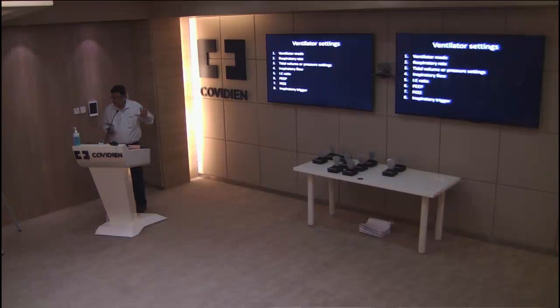And remember, pressure support is not a weaning mode. Pressure support can be used as an initial mode of ventilation also in a patient who's spontaneously breathing. Obviously, in a patient who's under anesthesia, you can't use that. But in a patient who's spontaneously breathing, pressure support can be used initially. You should keep the rate that you need to set. Obviously, that depends upon lots of things: PCO2, asthma, ARDS. We're really not going to go into all that. You all know the concept of permissive hypercapnia.